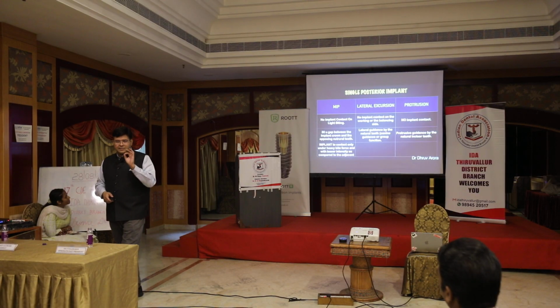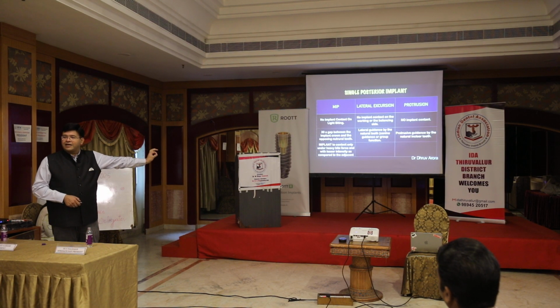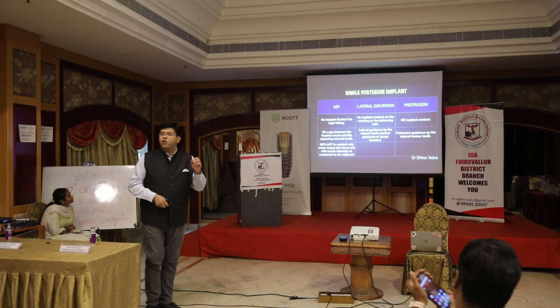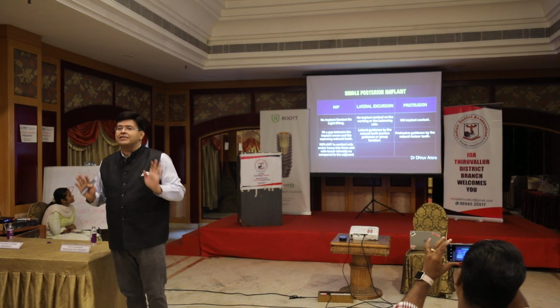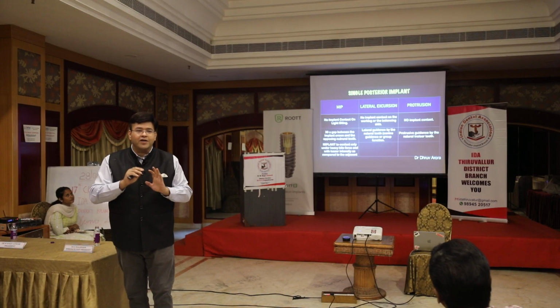What do I see in a single posterior crown? This is exactly what is required in a single posterior crown. MIP, no implant contact on light bite. What is meant by light bite? When I ask the patient to just touch the teeth. Just touch your teeth. When the patient is just touching the teeth, the implant crown should not come in contact.